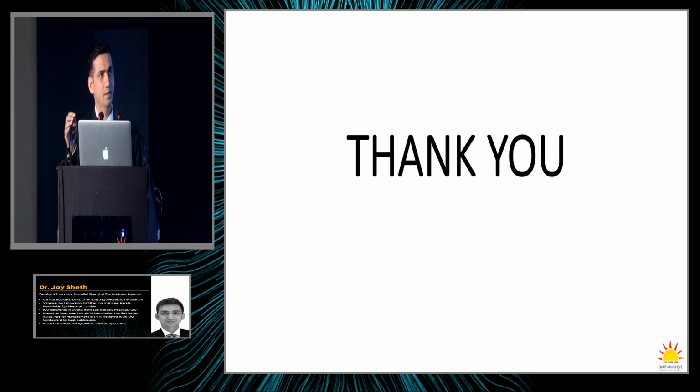True. And Anirudh, you brought out a very important point regarding the segmentation errors, because many times we see the scans are uploaded by the technician. So we need to look carefully at what section they have taken the scan. It's very important to spend half an hour after our clinics to see any interesting cases where we can ourselves do a slab selection, because since we have a lot of knowledge in this field, we would be able to find these minor lesions better than even our technicians. But we need to sit with our machine. That half an hour is the most difficult part to get.